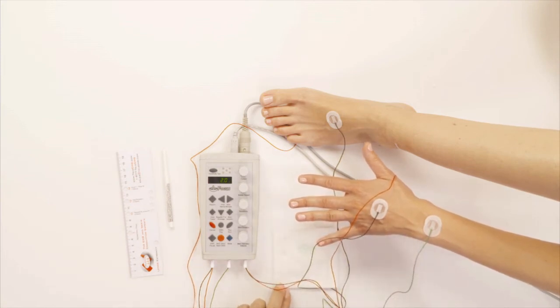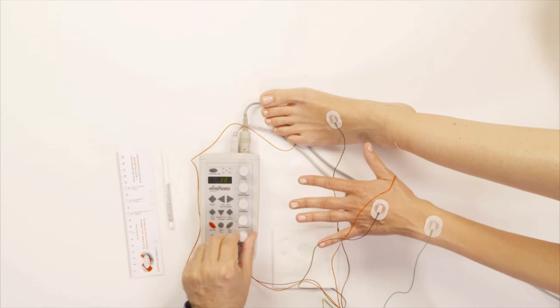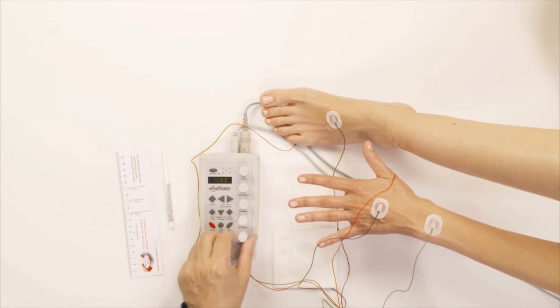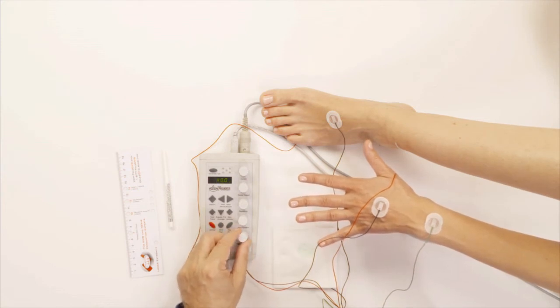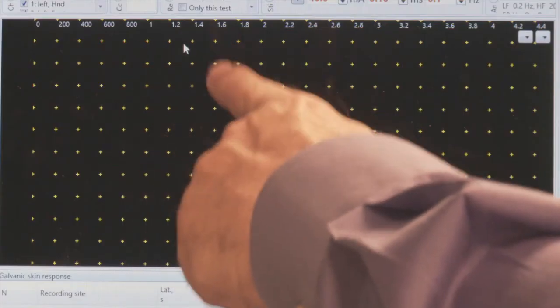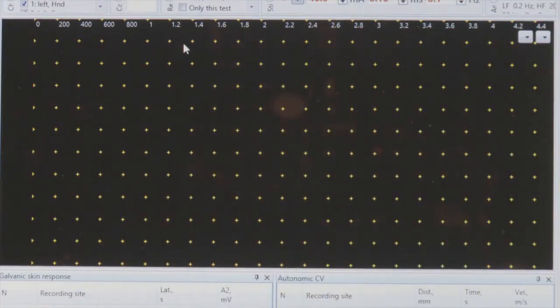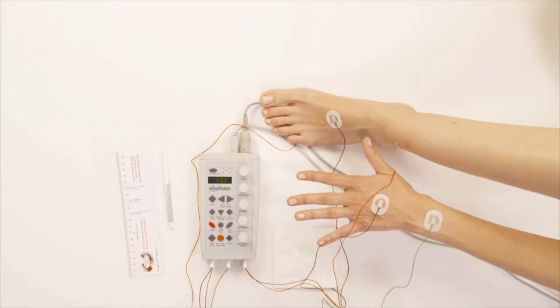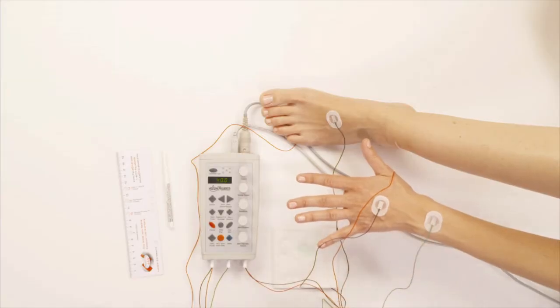And here, I do not do this with raising gradually the stimulus intensity. I put the stimulus intensity at 40 right away and I give her one shock, just one shock. And then theoretically, you're going to see some activities right here. And you're going to see two lines at the same time. That's coming from the hand and it's coming from the foot.